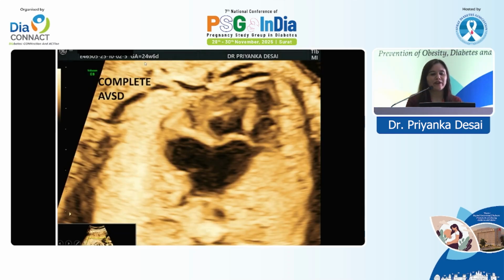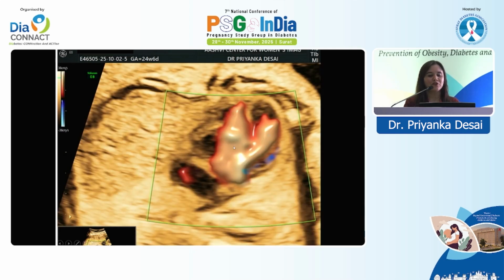Now she is a 24-weeker with type 2 diabetes, and what we can see is a grossly abnormal 4-chamber view of the heart, and here there's a big atrioventricular septal defect with discordant size of the ventricles. And this is the Doppler image which is showing a big hole. So this is a case of complete AVSD.